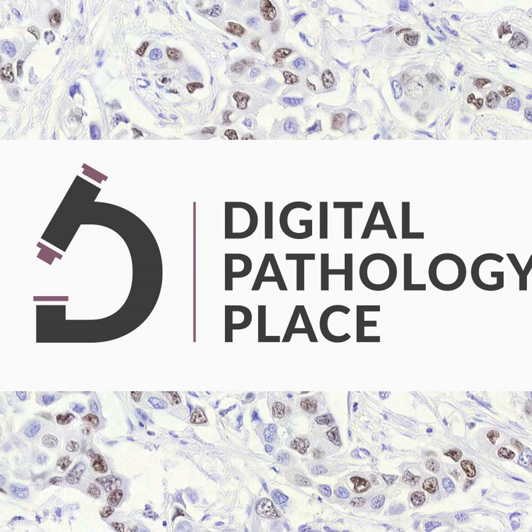Okay, LDTs and, say, FDA cleared or CE-IVDR marked devices have different regulatory paths initially. But here's the big point: all diagnostic tests, no matter how they're classified, have to go through local verification or, more likely, full validation before you can use them for patient care. Non-negotiable, then? Absolutely non-negotiable, because that local validation proves the tool works reliably with your patient population, your slide preparation, your staining protocols, all that local variability.